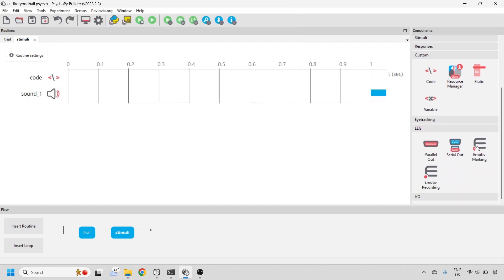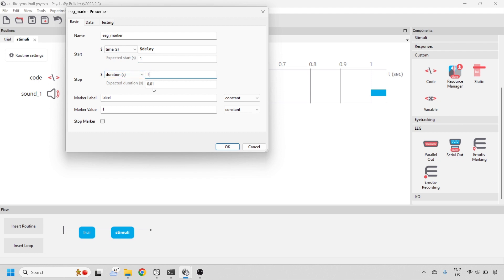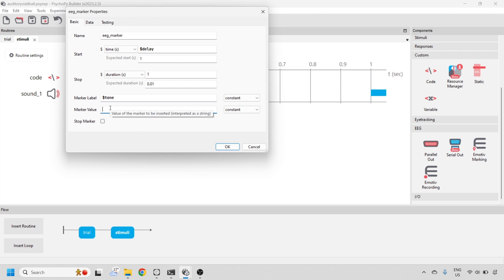Next, let's add an Emotive marking component. Here we'll add the dollar delay value so that we can send a marker the exact same time that a tone was heard. We can leave this duration as 1. And here we want the label to be the same dollar tone variable and the value, the dollar value variable, which we defined in the coding component.